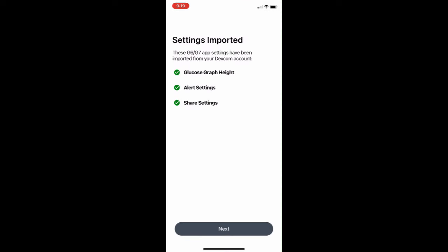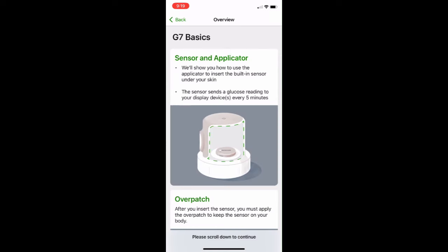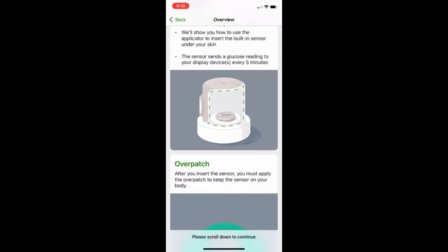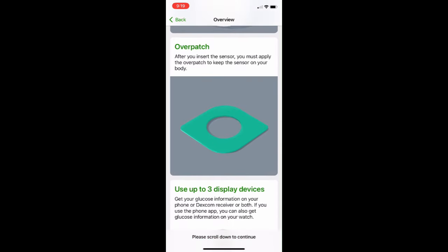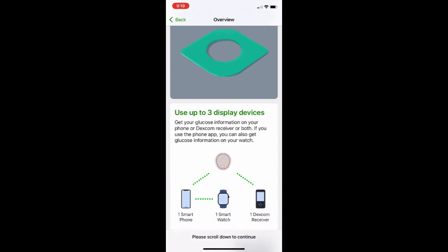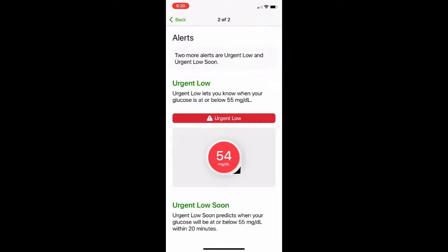It then imported my settings from the G6, which is pretty nice — means I don't have to re-enter those. Now it's going to give a full overview of how the G7 works, giving you all the details on the components and how everything works. This might be helpful for you to sit down and watch in your own time. You have to watch all these videos about how the system works.